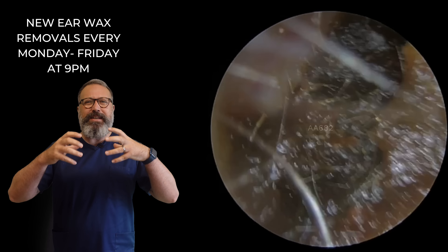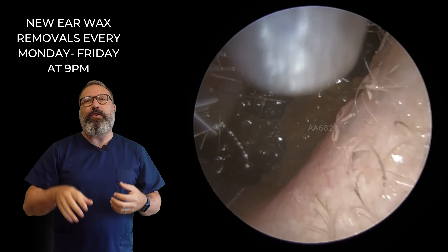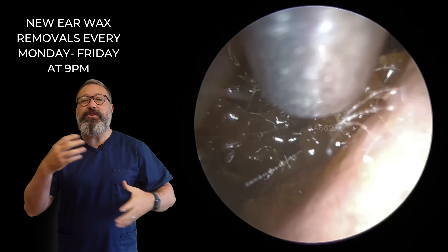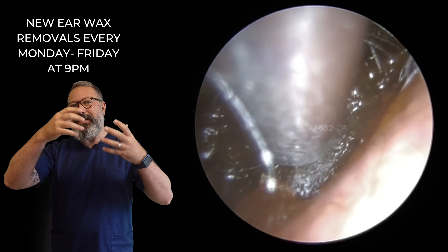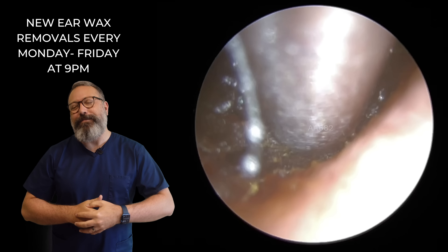Now this first one you can see is sticky — it looks thick and very kind of sticky around the edges. We've put a little bit of olive oil in here straight away, because we can see it is pretty sticky and the olive oil is going to help us get a better grip. It's going to coat the inside of the suction tube, stop the bits from getting stuck inside the tube, and help everything lift off the canal. Wonderful stuff is olive oil.